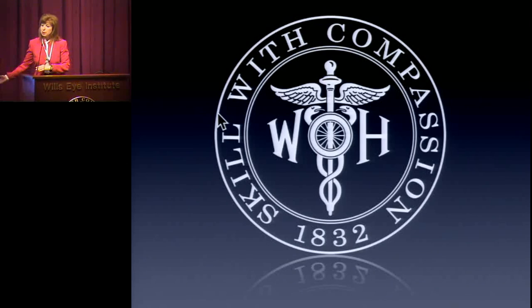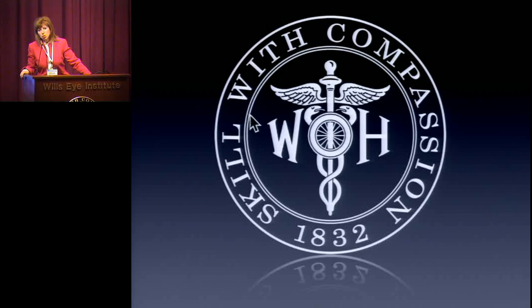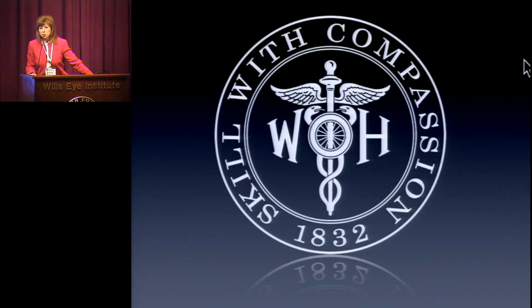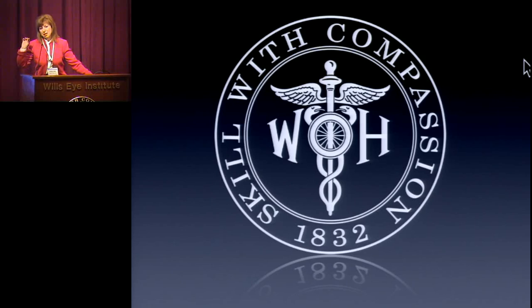However, just to play devil's advocate now, we all agree that structure changes before function. However, I'm not sure, and I've been looking at optic nerves a long time, that I can always tell when something is changing. Jack, can I have the slides? My slides. I just want to pick out something to show you. And what I find very, very helpful now is using the OCT, in addition to what we have, to really help us decide progression in the beginning.